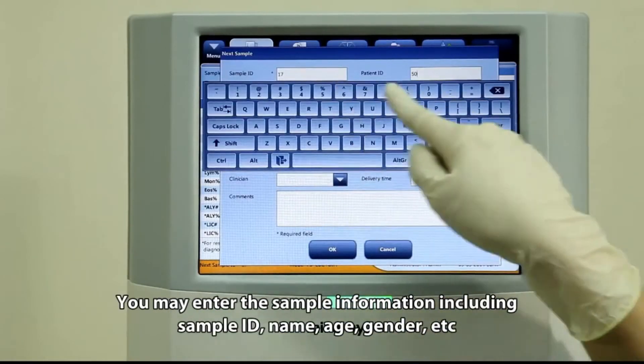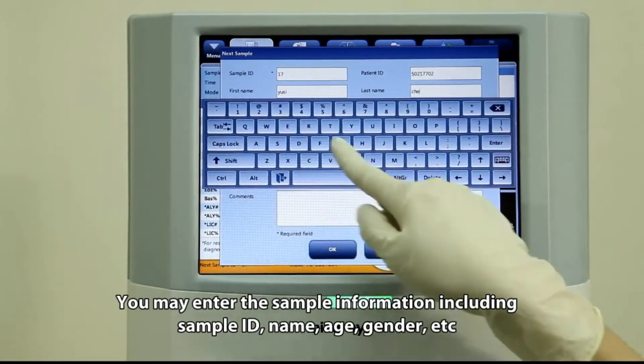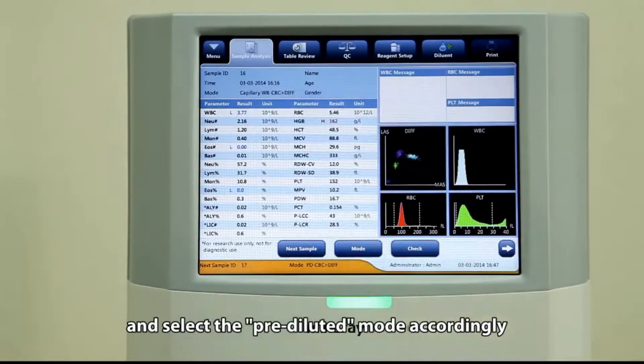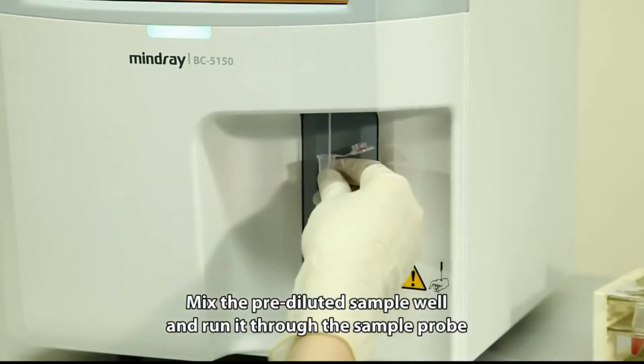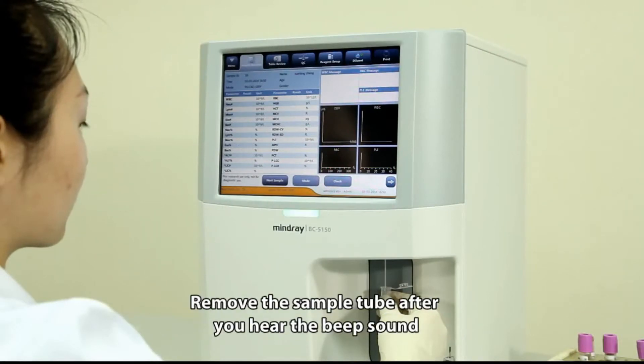You may enter the sample information including sample ID, name, age, gender, etc., and select the pre-dilute mode accordingly. Mix the pre-diluted sample well and run it through the sample probe. Remove the sample tube after you hear the beep sound.